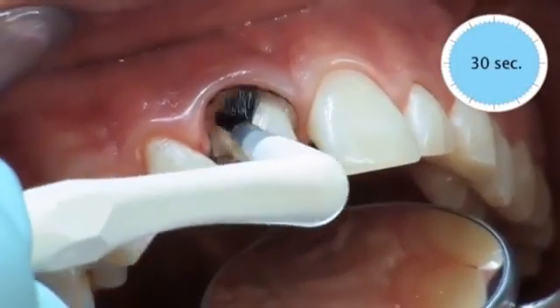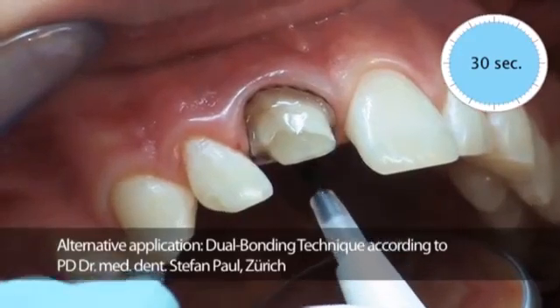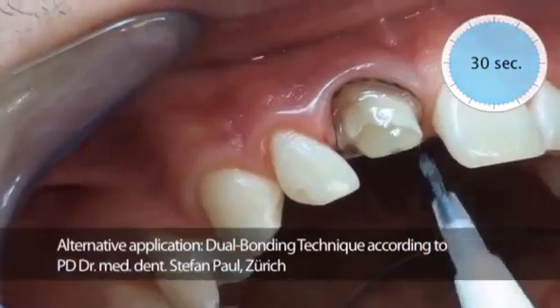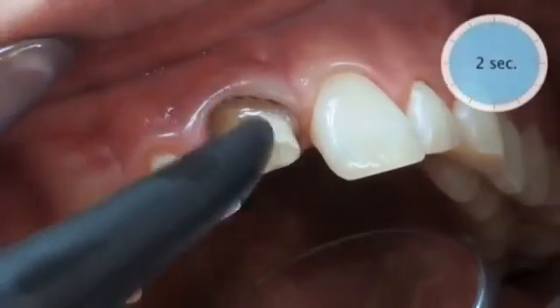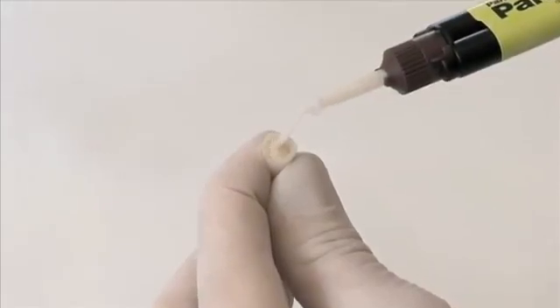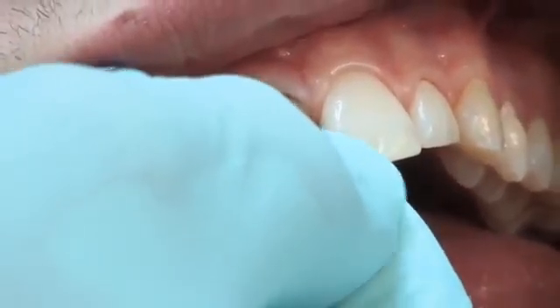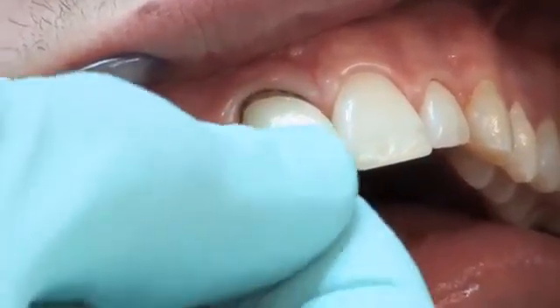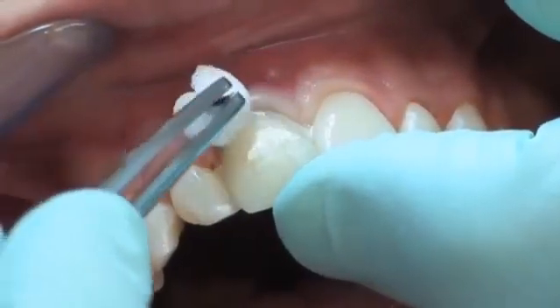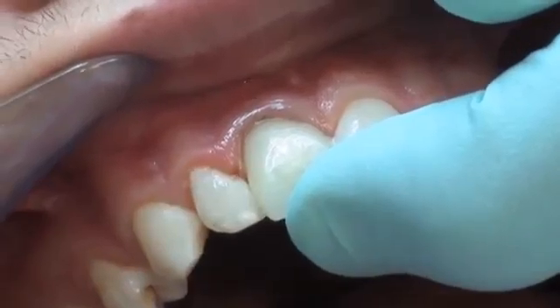Re-application of Parabond adhesive shortly before the final cementation significantly increases the retention of the Paracore cement. The application of Paracore for the cementation of posts, restorations and core build-ups guarantees an optimal monoblock bond interface between the post, cement, dentin and crown, resulting in one cohesive restoration with outstanding durability and strength.